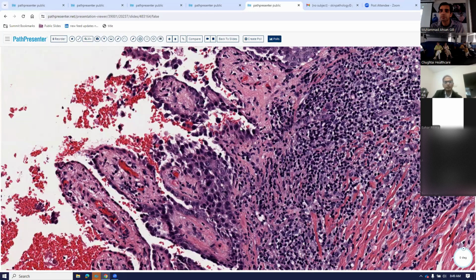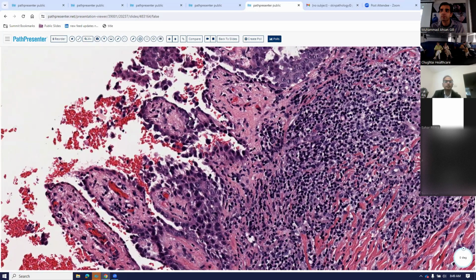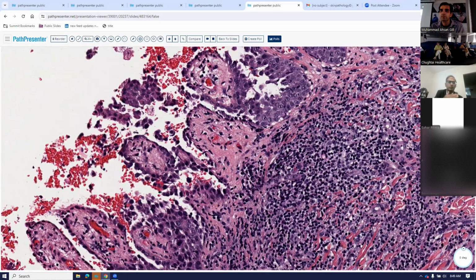But now there is treatment available. Most of these patients will survive. So that same terminology doesn't stick. But it is a good way to look at these cases because you can see this basal layer is almost like a row of tombstones that is stuck to the dermis. The rest of the epidermis is sloughed off basically. And if you do the immunofluorescence, again, you're going to see the IgG and the C3 fishnet pattern within the epidermis.